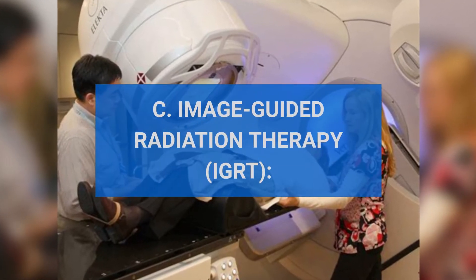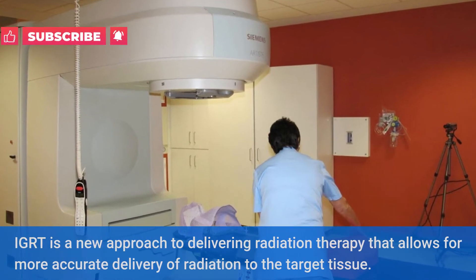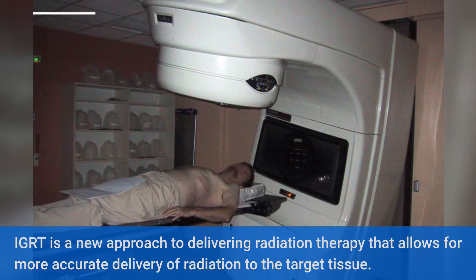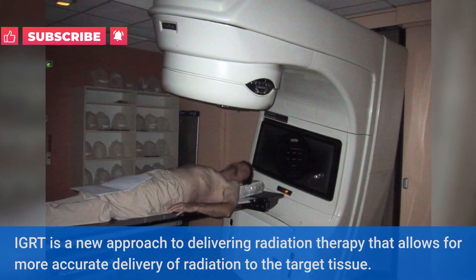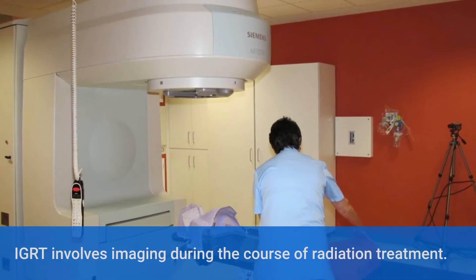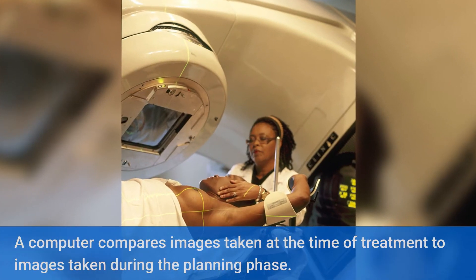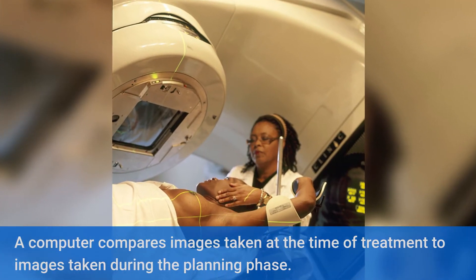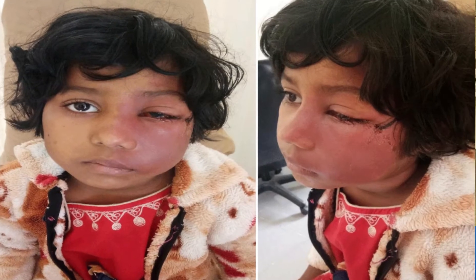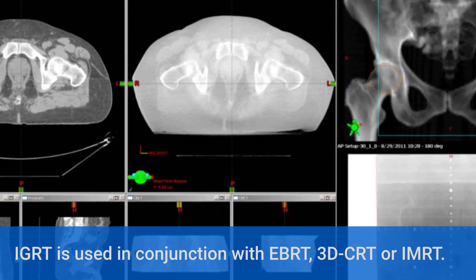Image Guided Radiation Therapy (IGRT): IGRT is a new approach to delivering radiation therapy that allows for more accurate delivery of radiation to the target tissue. IGRT involves imaging during the course of radiation treatment. A computer compares images taken at the time of treatment to images taken during the planning phase. IGRT is used in conjunction with EBRT, 3DCRT, or IMRT.